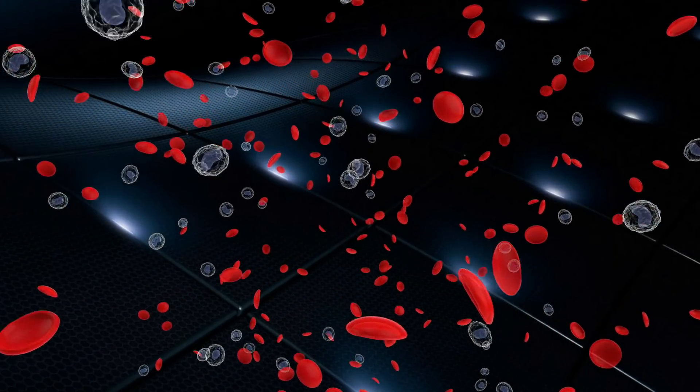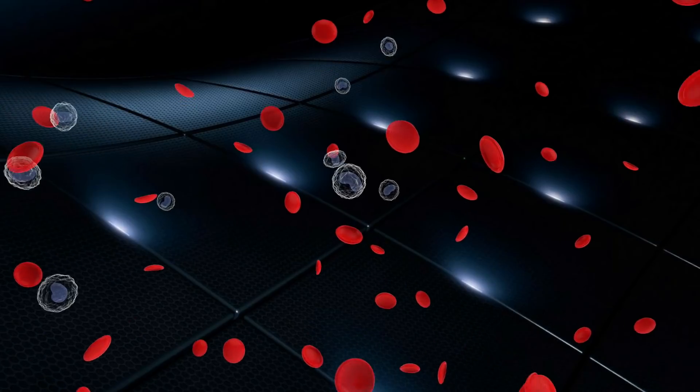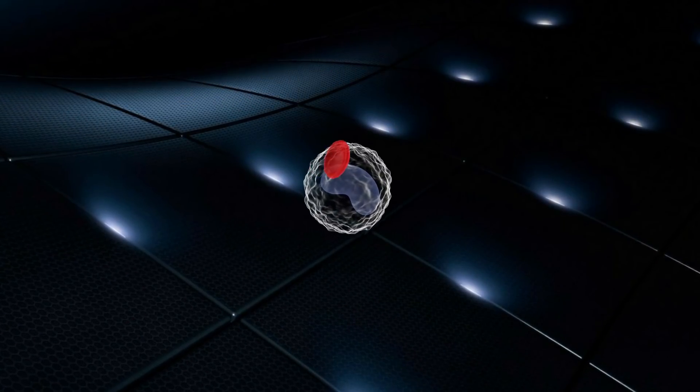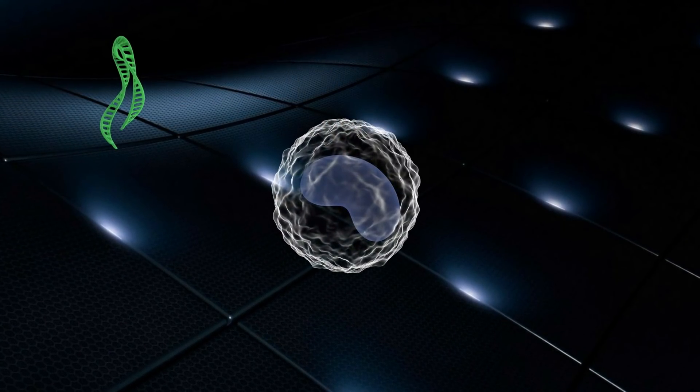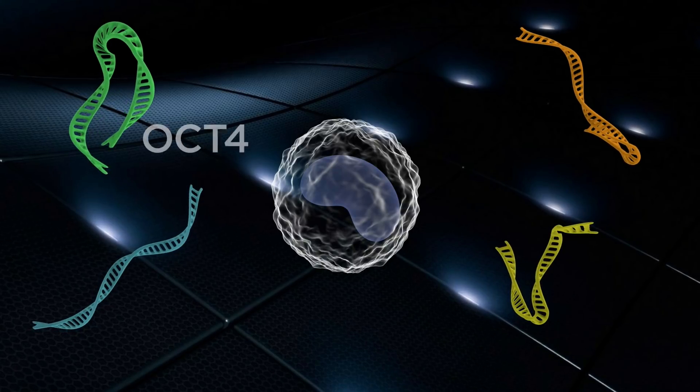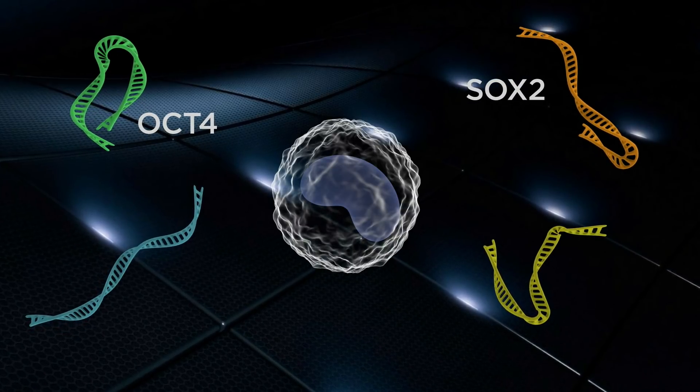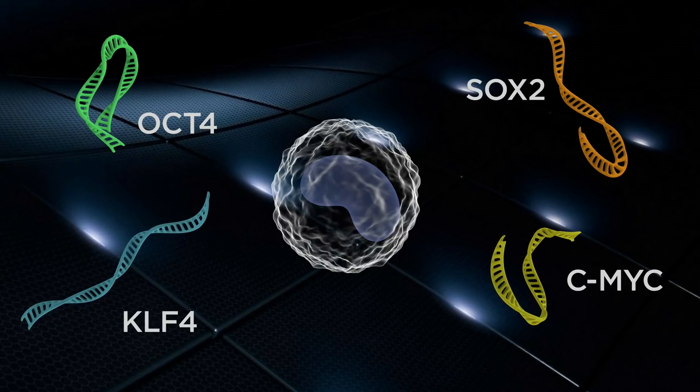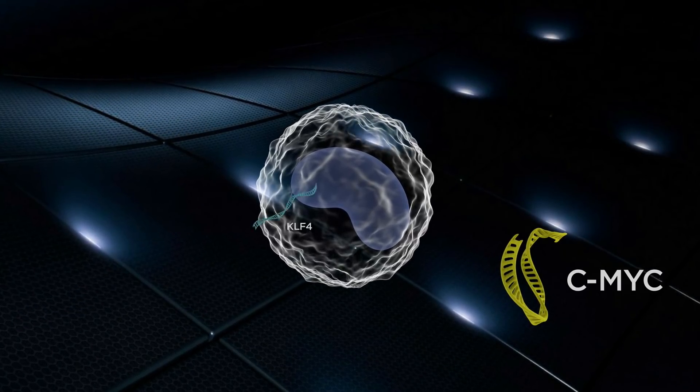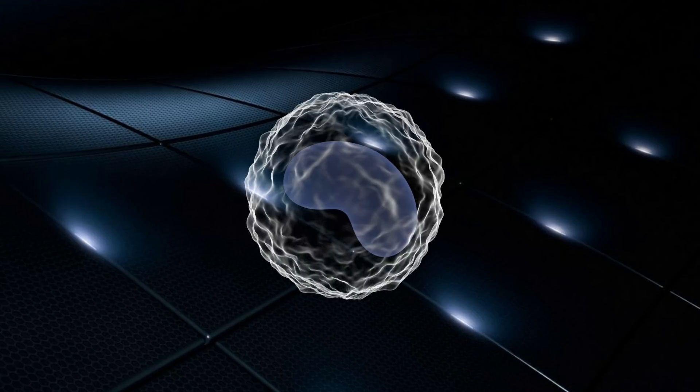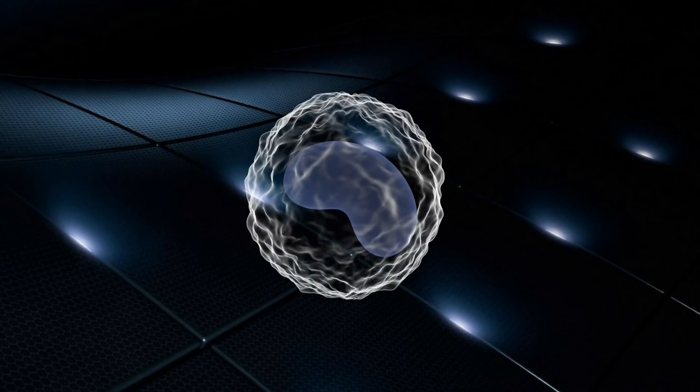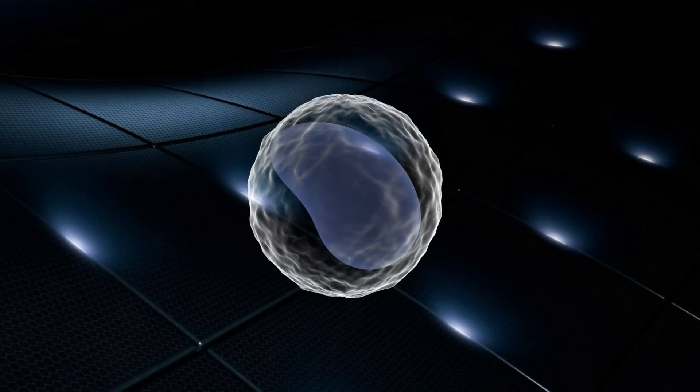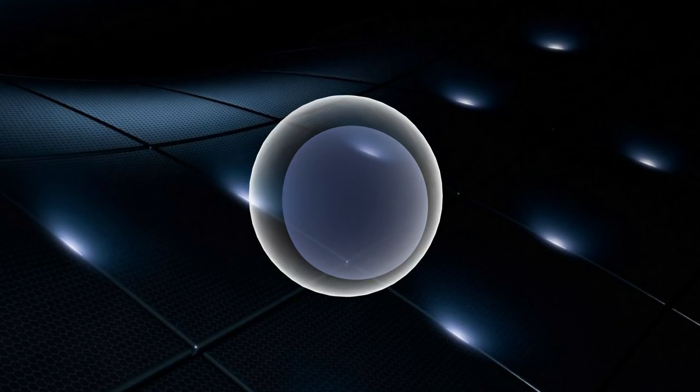To generate induced pluripotent stem cells, we first derive skin cells or blood cells from a healthy or diseased person. Then four defined genes are introduced into these cells: OCT4, SOX2, KLF4, and c-MYC. As a consequence, over the next three to four weeks, these cells, such as blood cells, change their identity and get reprogrammed into iPSCs.